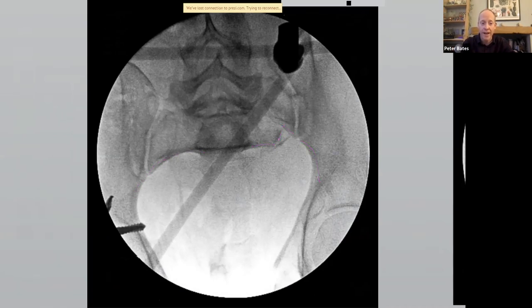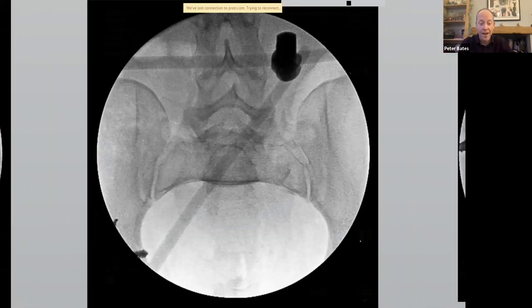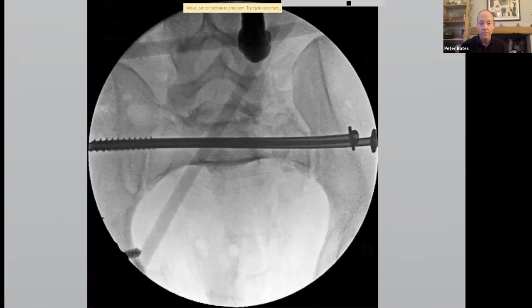So how are we going to correct that? Well, we've locked off this side of the pelvis here. See those two pins there? Those are the ones stabilizing the right side of the pelvis. And now we pull on the left side. And what happens? There we go, you pull forwards. Hooray! It's now reduced. Now look, lovely line coming across. All looks good. The two sides are symmetrical, and so we can now shoot our screws through. Boom.